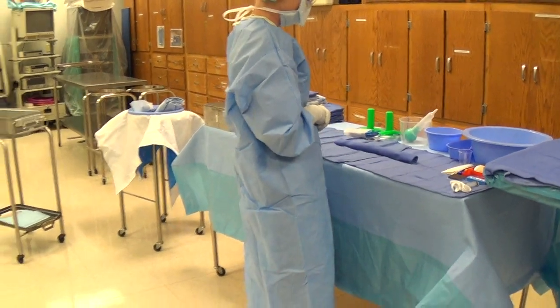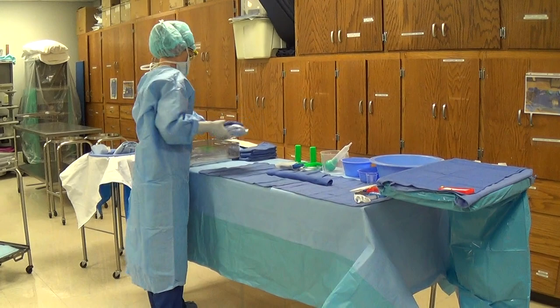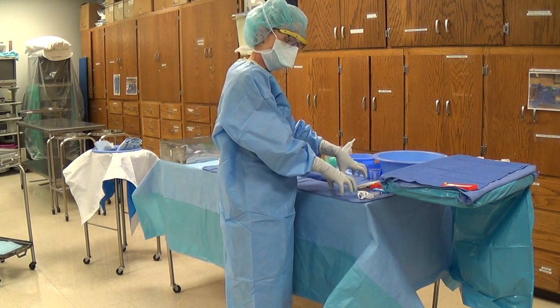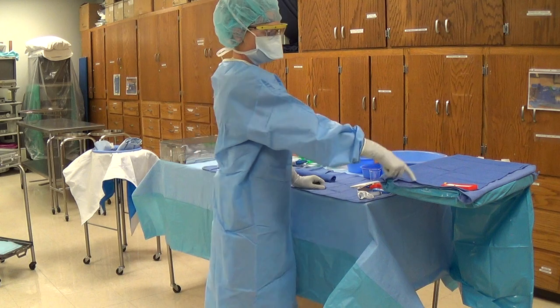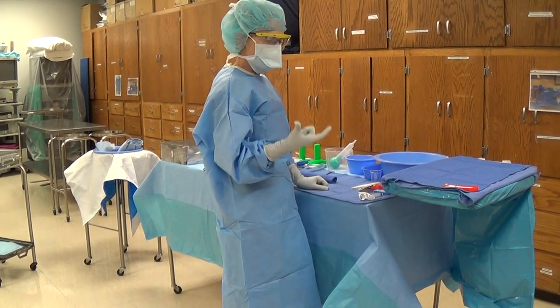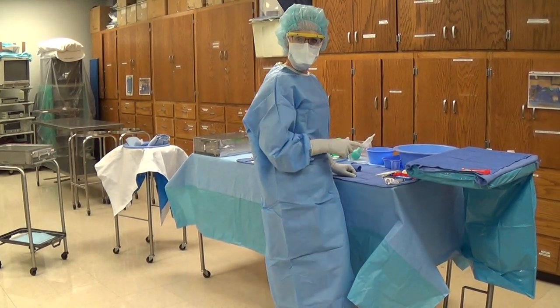At this point you will say that you are ready and you are ready for your surgeon. If you had sponges like Raytex or laps, those kinds of things would be right over here as well. If your hospital happens to have a knife protector, we will put that up on the mayo stand — some facilities have those, some don't. This pack happens to not have one, but it's a knife protector and we'll go ahead and put that right up on the mayo as well.